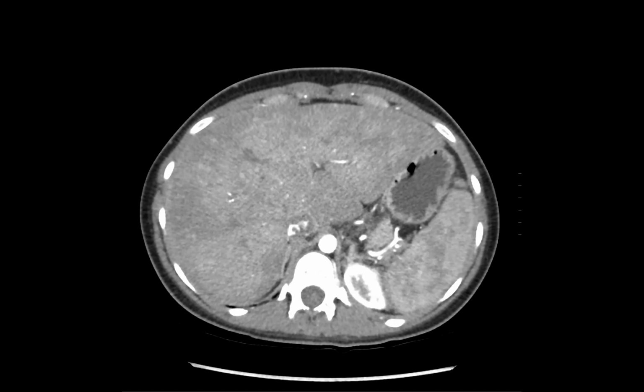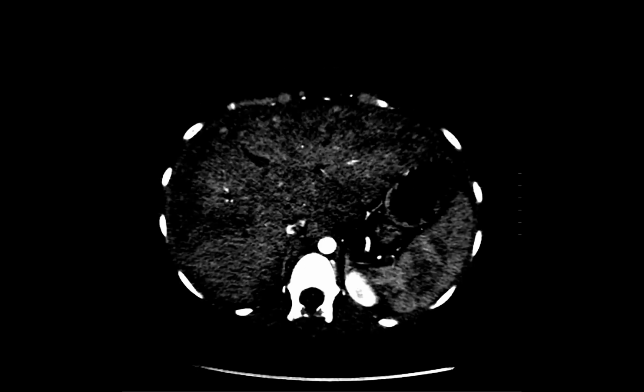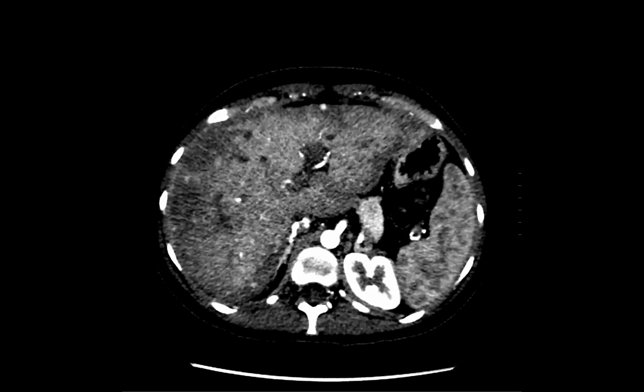Got it. I know sometimes in acute Budd Chiari they'll also do a TIPS. Yeah, that's what they were trying to do, TIPS. But they couldn't. The middle hepatic vein was completely occluded, and so they couldn't gain access to the IVC. Got it. So they weren't able to do the TIPS, unfortunately. Yeah, because sometimes the acute congestion can really hurt the liver, so they're just trying to open it up.